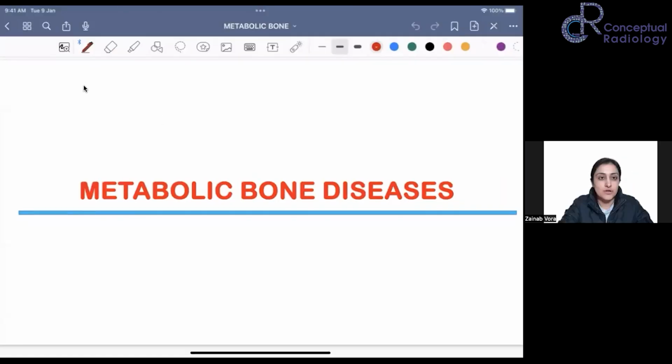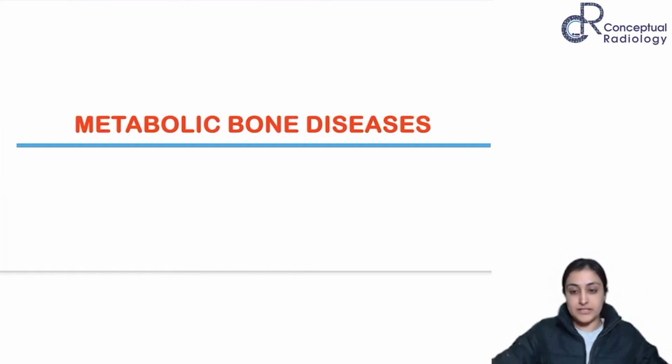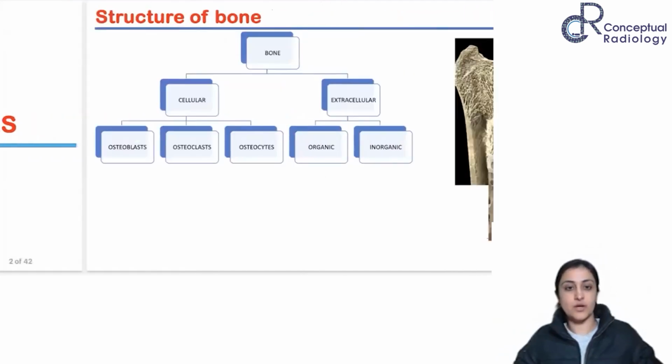Just going to share the screen. All right, okay, so let's start. Do keep interacting and letting me know what you think about the case. Fine, so that's how I have made the presentation, in which you'll be able to see a few cases and you'll have to diagnose, and then we'll discuss that condition. Okay, all right, let's start.